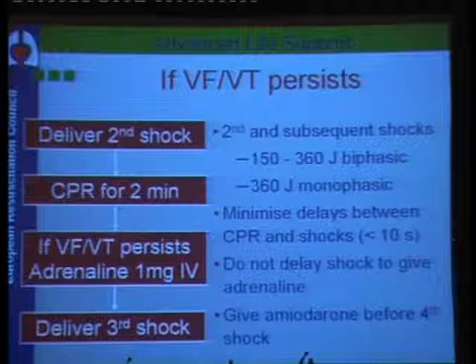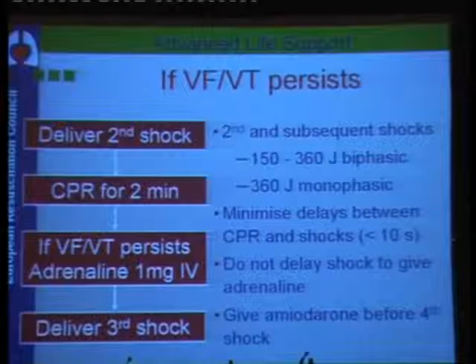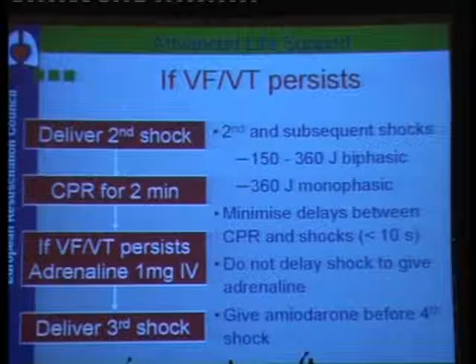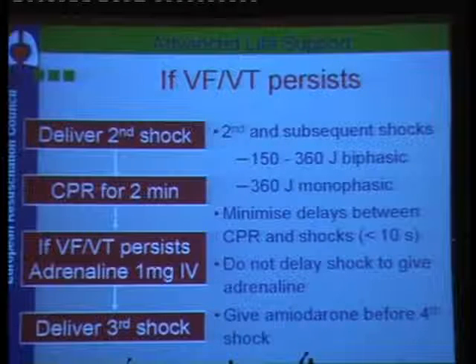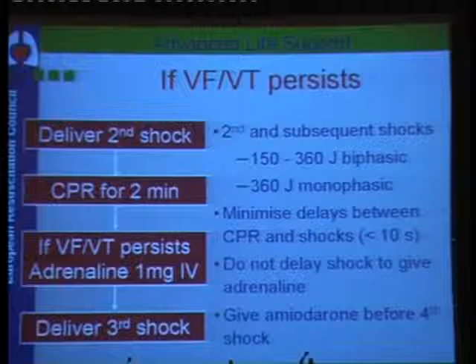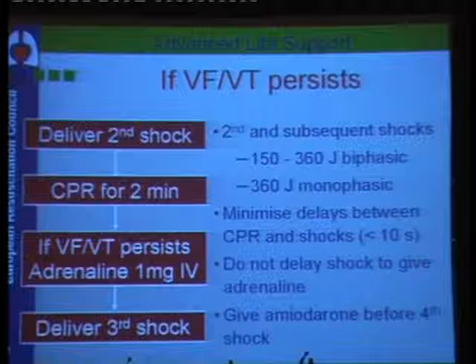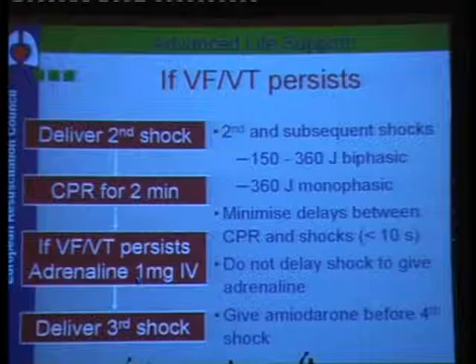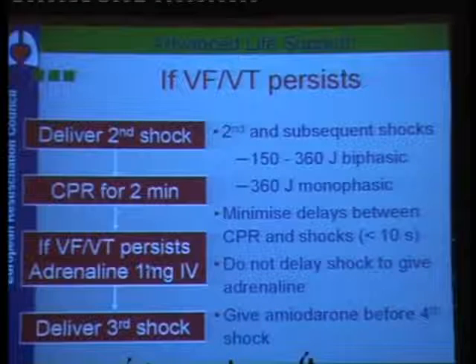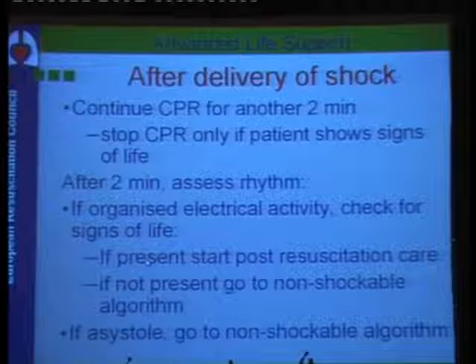Clear? If you continue the CPR, and in the meantime a monitor has come and you have attached it, the waves will be everywhere, so you will say just hold on for a second, look again at the rhythm there, and if it is still the same shockable rhythm, you give the second shock. And you know that your drugs are there, you give your adrenaline before your 3rd shock, and if it needs to be continued, then after the 3rd cycle of the CPR, you give your amiodarone.